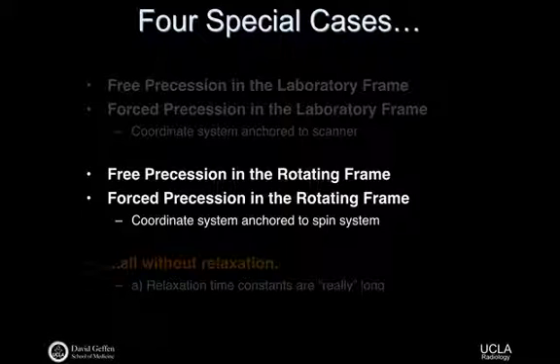So depending on how I can use the board over here, these are sort of procedurally the steps that we're going to work through. So the first one is to talk about what's the B1 function that we maybe care about. And in the general sense, the B1 function, B1 as a function of time, is easily described in the laboratory frame. That's what we just talked about. We talked about this RF birdcage coil and oscillating currents and setting up a B1 function for that field.